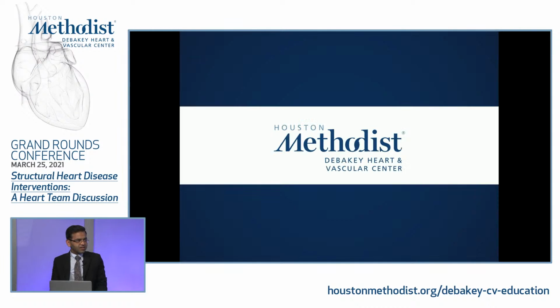Great. So this is a great case, again demonstrating the utility of electrosurgery techniques which have evolved over the last few years in not just the mitral space but the aortic space as well. We have had experience with the LAMPOON procedure as well as the BASILICA procedure. These are electrosurgical techniques to lacerate leaflets, either mitral or aortic. In this case, it was to reduce the risk of LVOT obstruction from mitral valves, and in the case of aortic valves during TAVR, to reduce the risk of coronary obstruction. These are revolutionary techniques which have evolved in the last 5 years, and more and more evidence is being gathered on the safety and efficacy of these techniques.